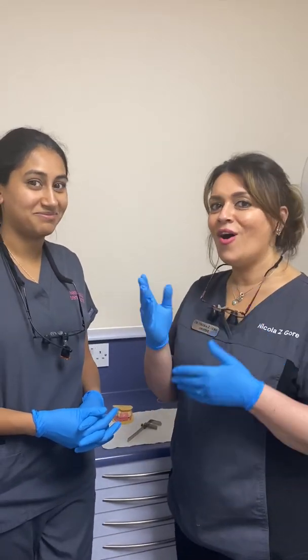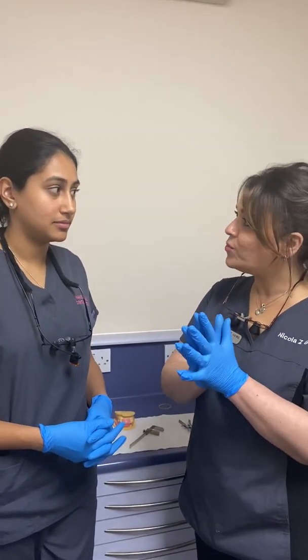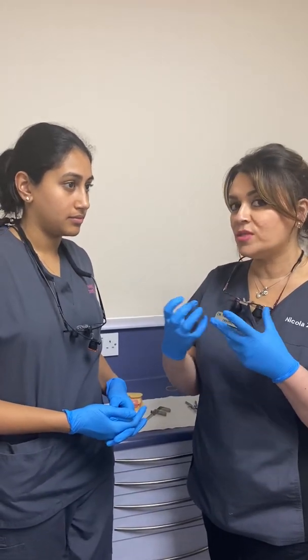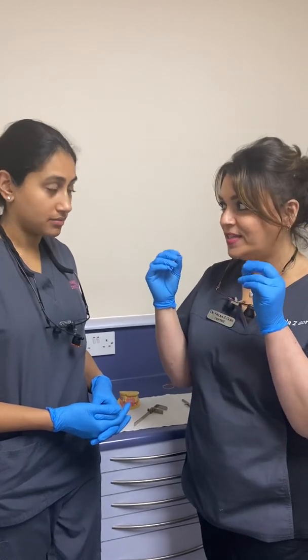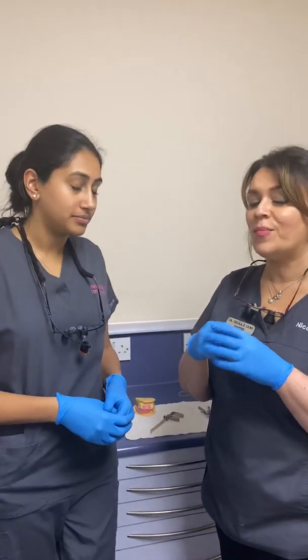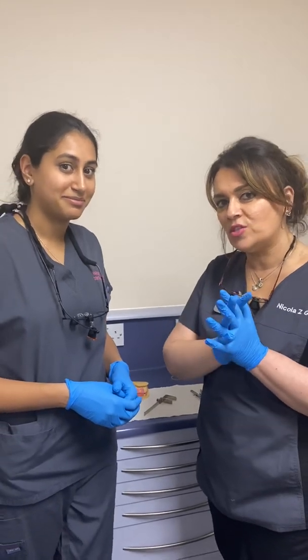The reason we check RVD and OVD originally is because we want to see how much freeway space there is. RVD minus OVD equals freeway space, and on average freeway space is two to four millimeters. You don't want to make that freeway space bigger or smaller. If you make it smaller, it affects speech — the phonetics of the patient — and it can affect chewing. Some patients come in saying they can hear their teeth clicking together when they eat; that's because there's a lack of freeway space. If you increase it too much, the patient will be over-closed and it gives them the appearance of an aged face.